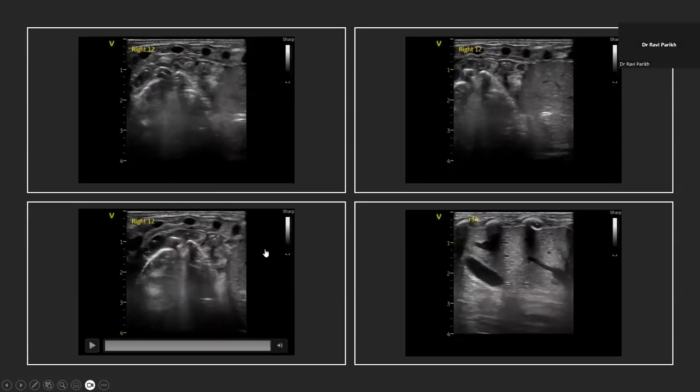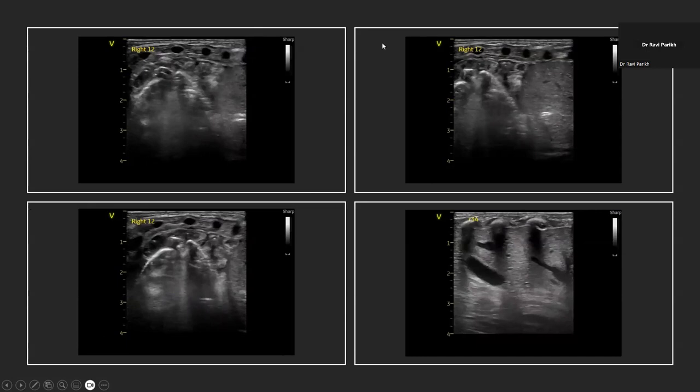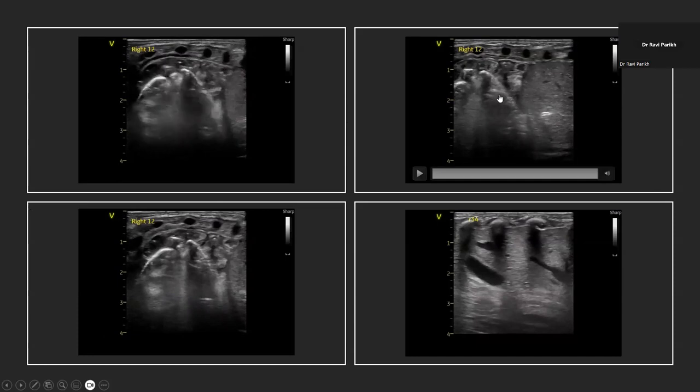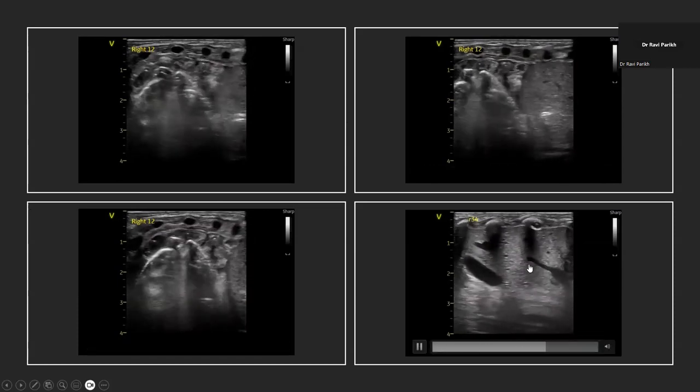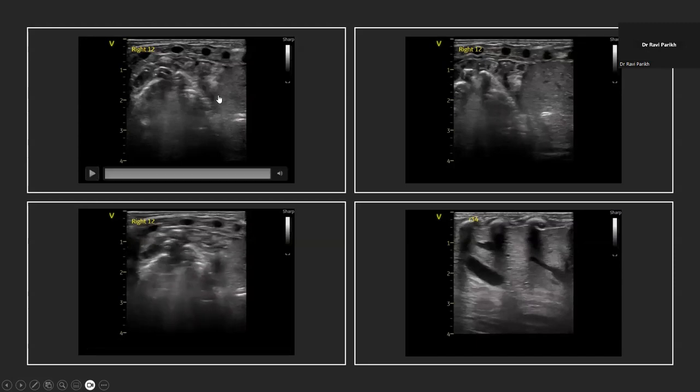So I was trying to see whether anybody decides that you must do a comprehensive scan. Just assuming that this is a diaphragmatic hernia and it explains everything is not enough. You need to make sure that you've scanned all regions before you make your diagnosis.